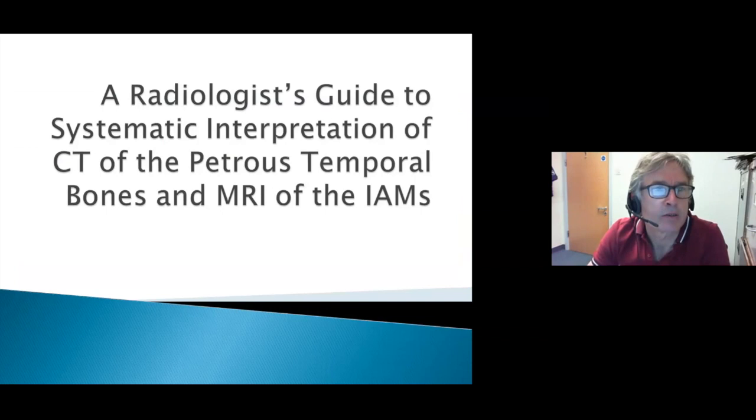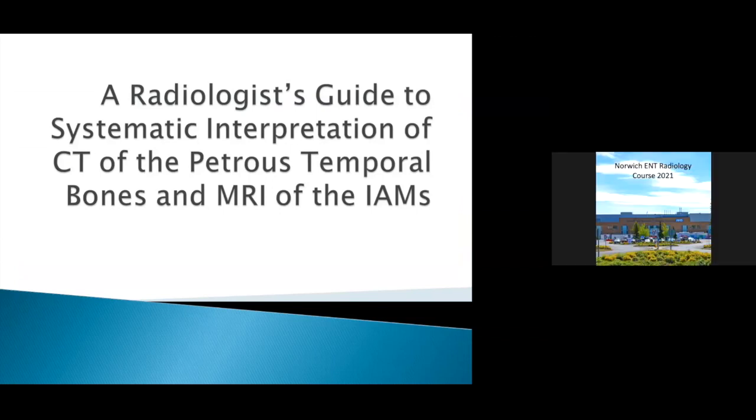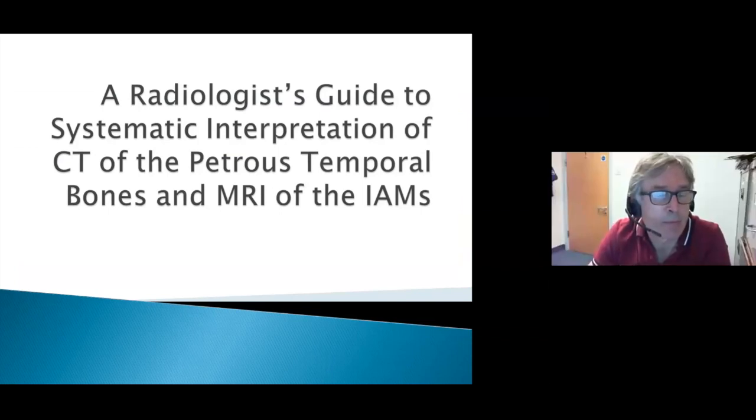I've been asked to talk about, it's a bit of a mouthful, a radiologist's guide to systematic interpretation of CT of the petrous temporal bones and MRI of the IAMs. Now, that's not entirely correct, or at least half of it is correct. I'm going to talk primarily about CT of the petrous temporal bones and mention in passing MRI and where it fits in. Let's see how we go.